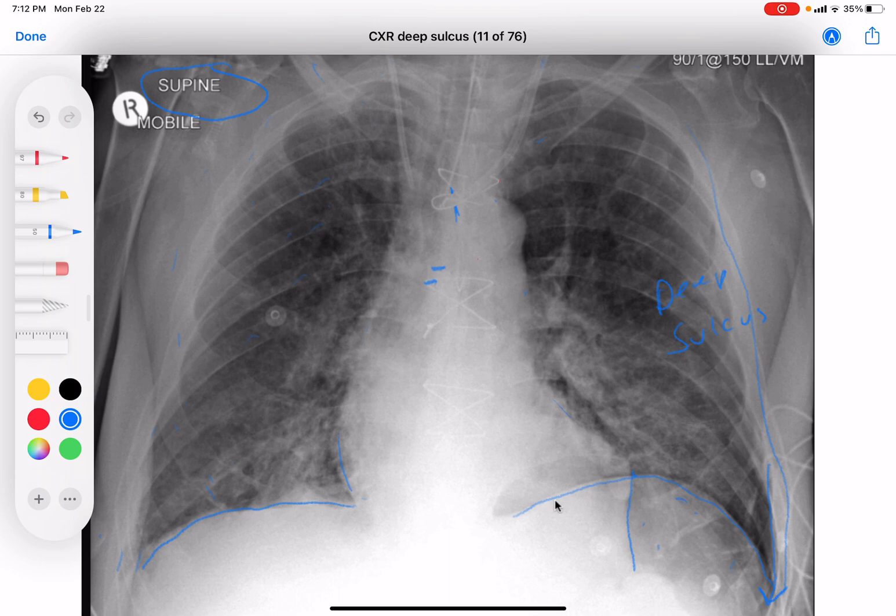We also have an endotracheal tube coming down here. It looks like it ends right about there, which is fine. The carina is right here, so it looks like about four or five centimeters above, which is a good position for the ET tube. That's the end for this chest x-ray.